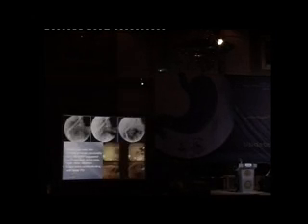This is, for example, one of the cases here of a patient who came with recurrent pancreatitis, and we found on the MRI and MRCP that he had a pancreatic pseudocyst in the tail of the pancreas communicating with the pancreatic duct. And when we did the ERCP, there is a stricture here, and this is the cyst here. The stricture was dilated with the balloon dilator, and then we put a 10 French, homemade pancreatic stent. It's very important to keep in mind that a pancreatic stent has to have multiple side holes, otherwise it will cause pancreatitis, not like the biliary. And you see a gush of fluid came down to the duodenum, and then this is the 10 French stent.